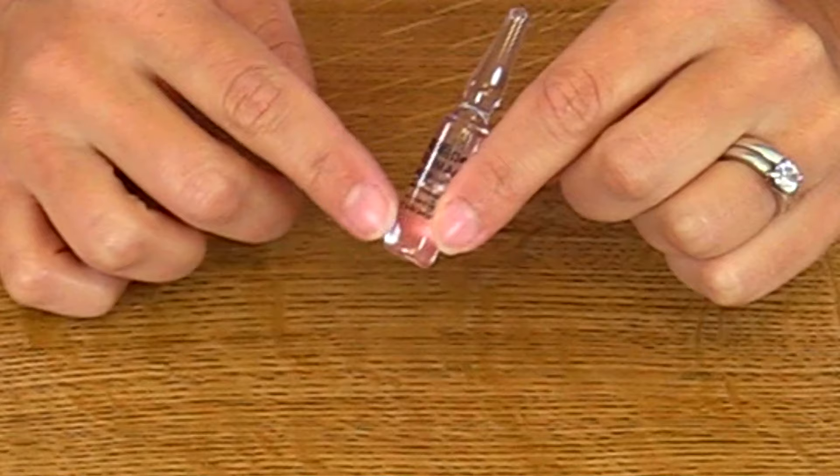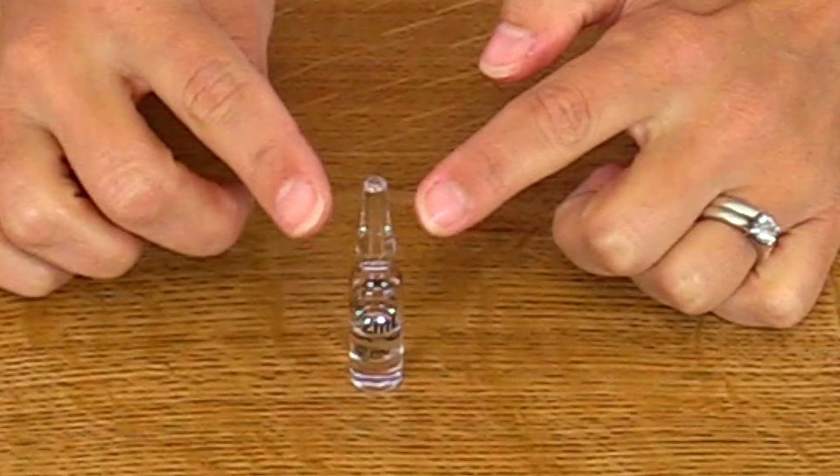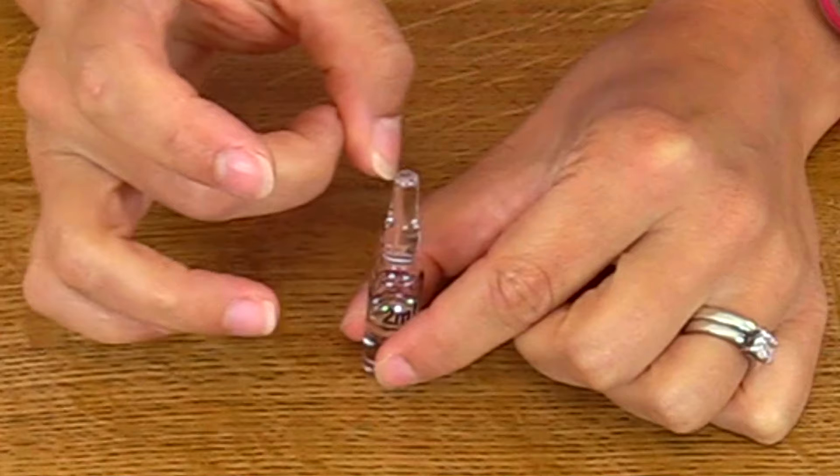Then you want to make sure that all the liquid is down in the body of the ampule, because sometimes it likes to collect up in the head. So just hold it steady and lightly tap or flick the top of the ampule and the fluid will go down into the body.